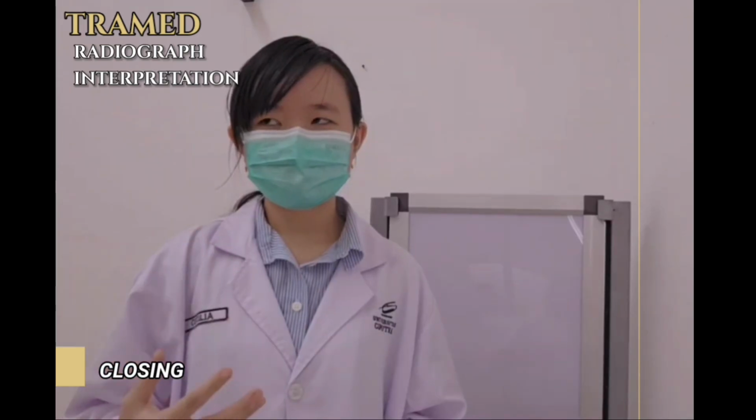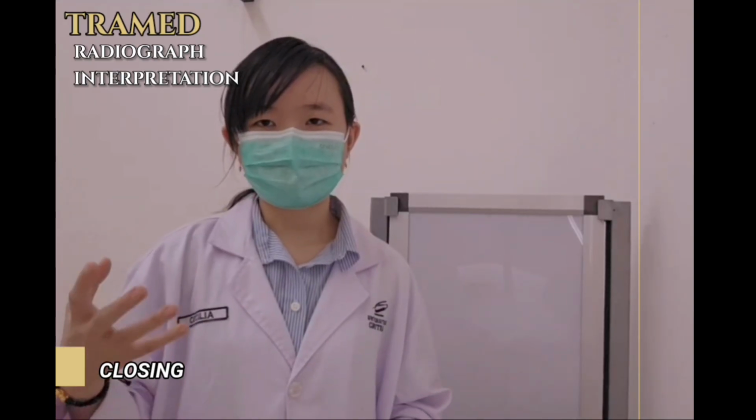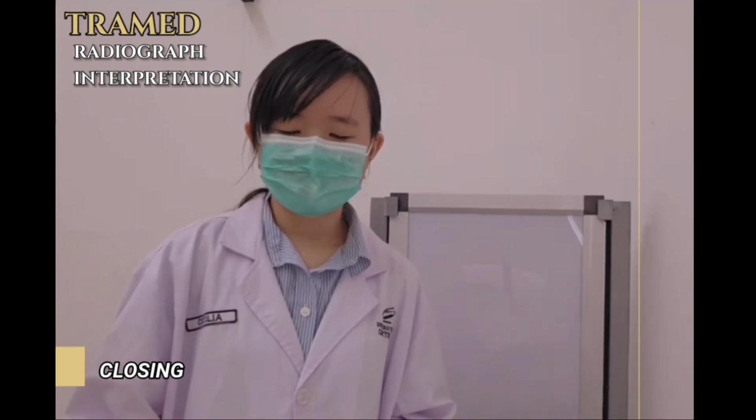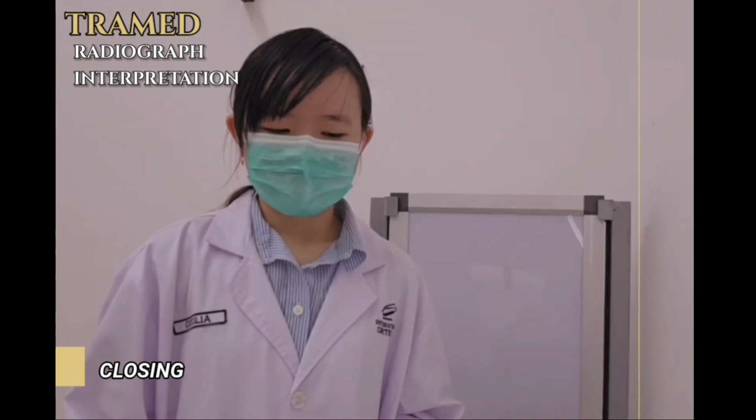And after that, we must explain to the patient that overall from the skull, the chest, the abdomen, and also the extremities and the other parts are still in the normal range. There is no fracture and overall is normal. And after that, we must ask the patient, is there any question? And if there is no question, we must deliver all of the medical records of the radiograph images, with the medical information of the patient and education in the medical record.